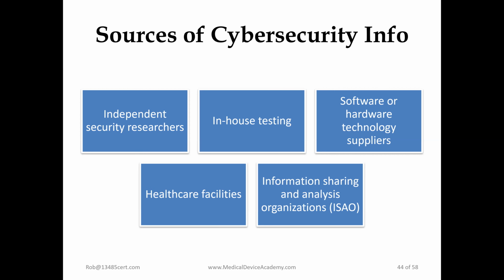So that's highly recommended by the FDA that you participate in one of those. And you have some special privileges and permissions if you do have active participation in those. So that's worth looking into if you have a device that is going to require robust cybersecurity.